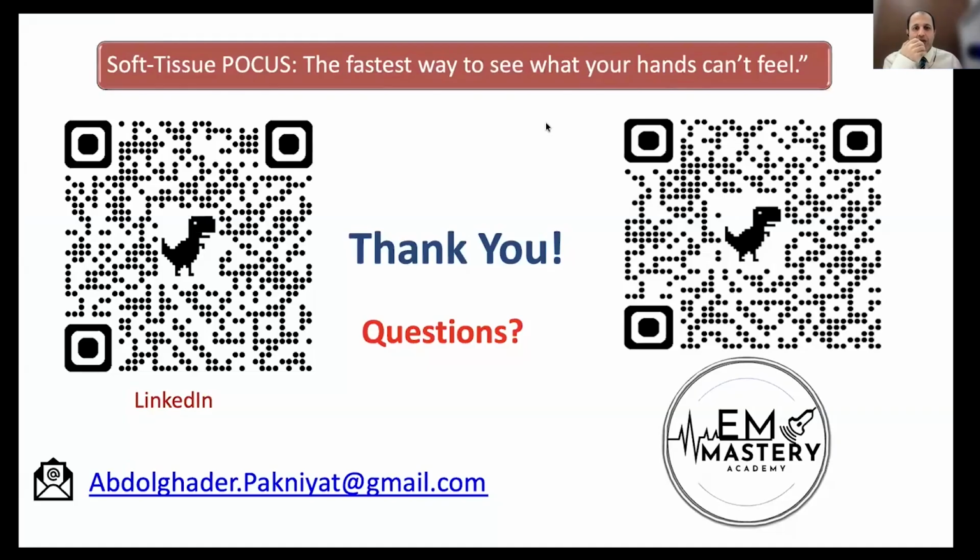That's why we always need to put pressure to see whether the pus is moving or not. Normal fat we don't expect to have any movement, but if you see movement in the structure, it means it is pus and not normal fat. It's in some cases where the abscess is formed inside very thick fat, like the buttock or thigh, that we can have such a misdiagnosis.